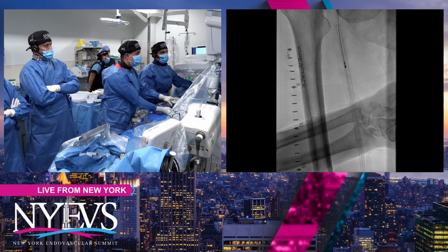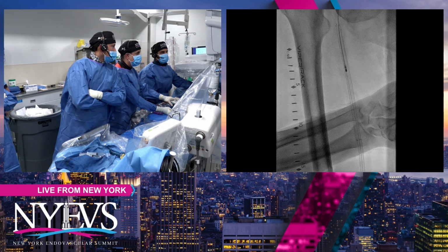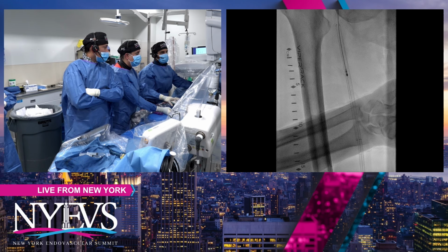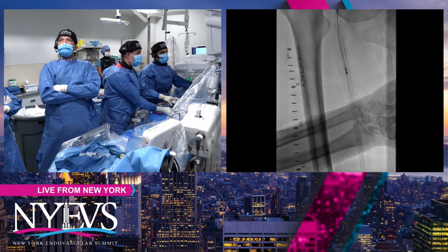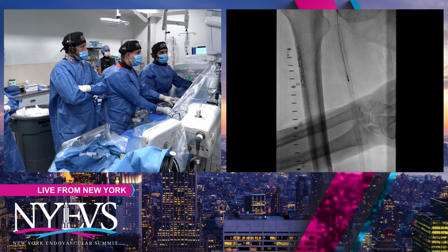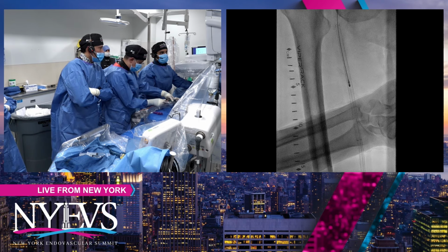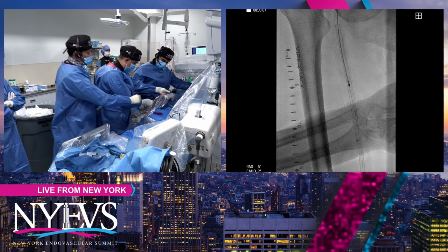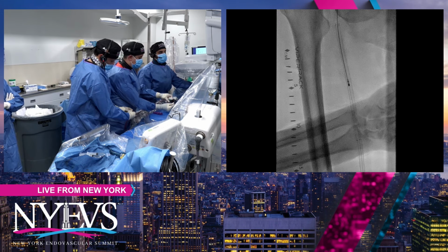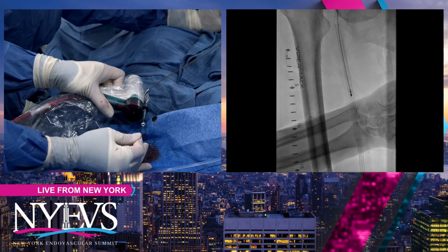I think laser would have been okay here too, because you have atherosclerotic disease below the stent that you're going to treat, and at the origin of the ostium. Personally, I just prefer to use that to have multimodality treatment. But the other thing is the difference between the devices and the size of the devices: how important is it to really massively debulk and then do your final treatment? Let's just assume that they've decided that ideally they would use a DCB. How important is it to massively debulk versus debulk it enough?